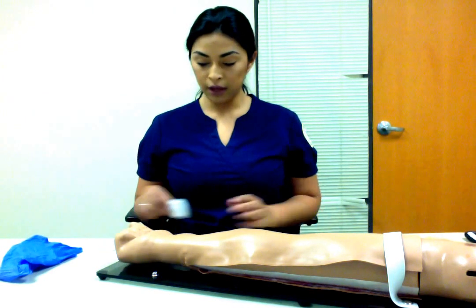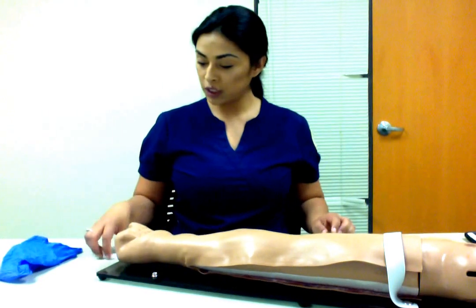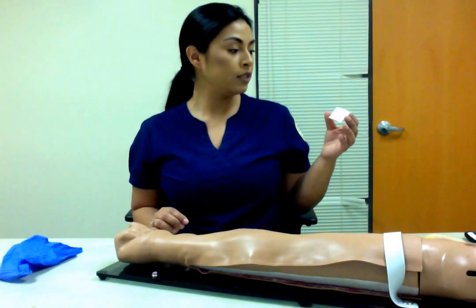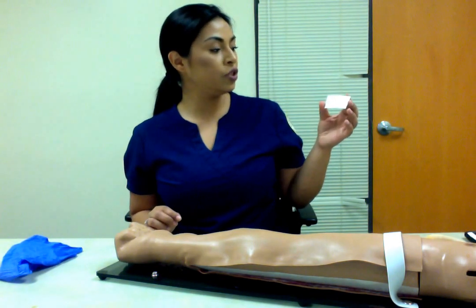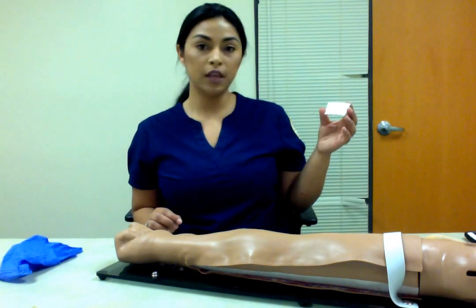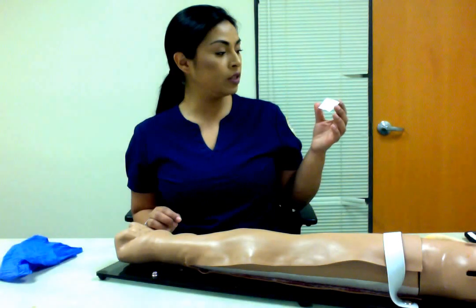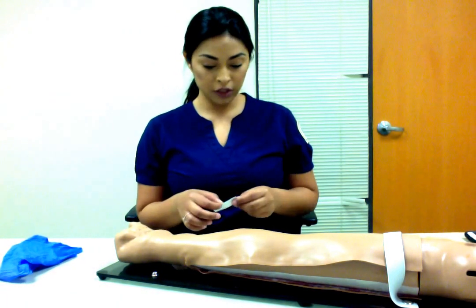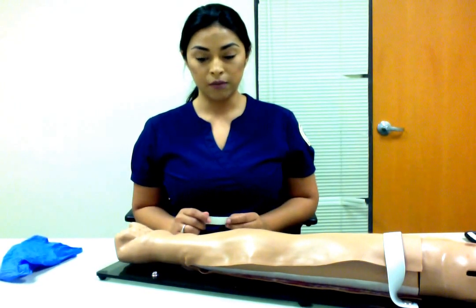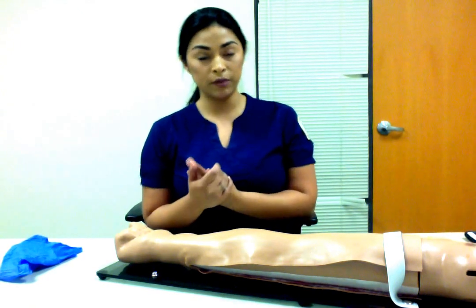Once you have gathered all your equipment, you would fill out your requisition slip. So you would put the patient's first and last name, date of birth, the patient's temperature, the room number, the date, the time, the type of test you are performing, and the FiO2 settings and devices the patient is using. You want to make sure that the patient has been on these settings for at least 30 minutes before performing the procedure. At that point, I'll perform hand hygiene before entering the room.